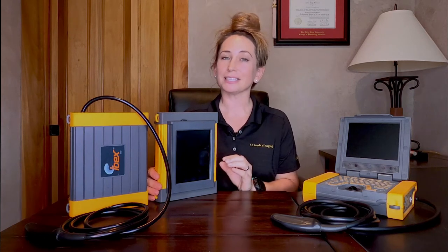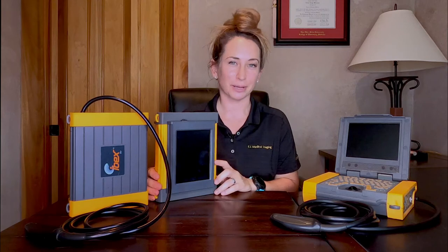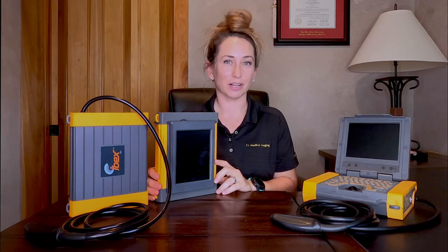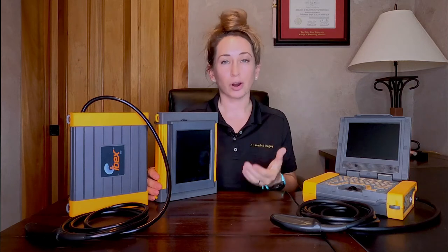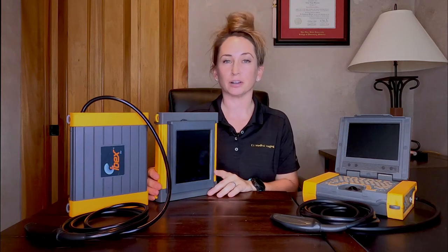All three models come with the option to either have interchangeable transducers or they can be hardwired to your favorite probe. This is where some of the naming convention that might be confusing comes in. For example, we have the original IBEX Pro, we have the IBEX Pro R which is hardwired to a linear rectal probe, and we have the IBEX Pro C which is hardwired to a curved rectal probe.